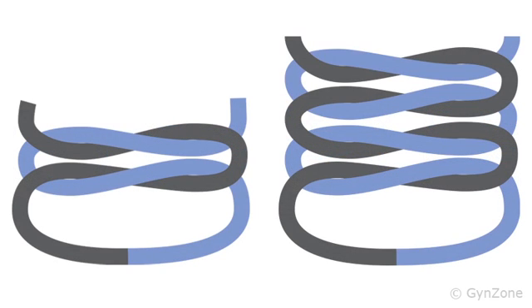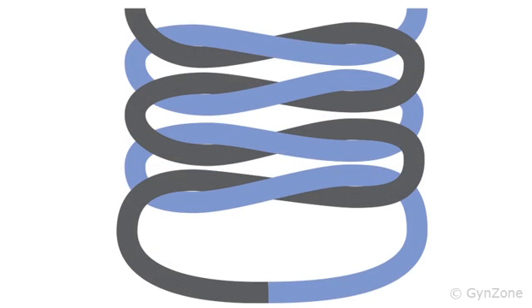In other words, it consists of a regular square knot which has received two additional throws in order to strengthen the knot. It is common practice amongst manufacturers of suture material to recommend at least three and up to five throws in order to create a stable knot.